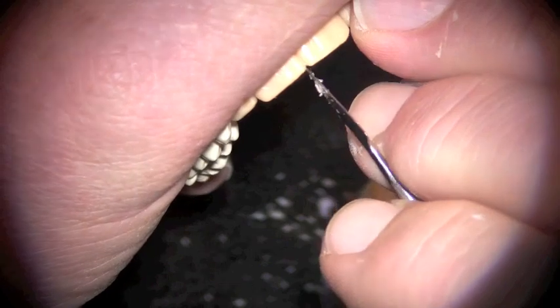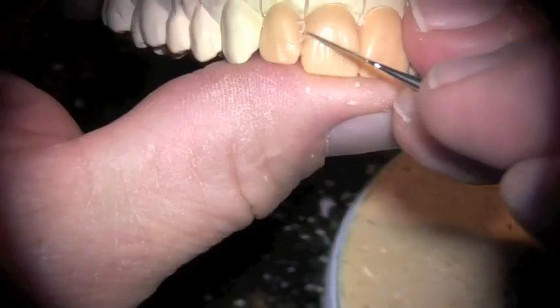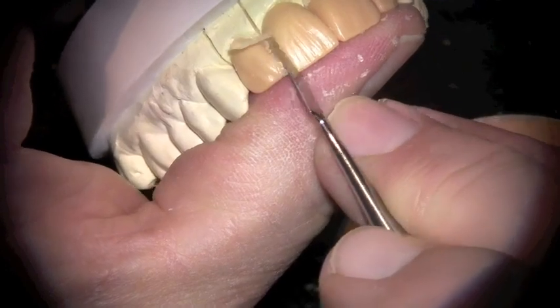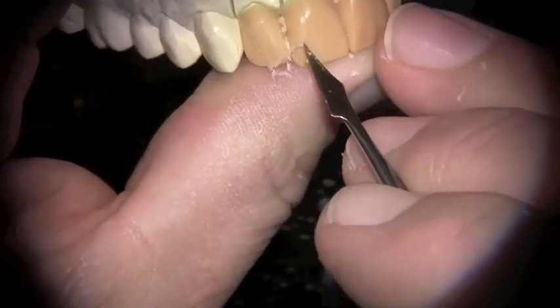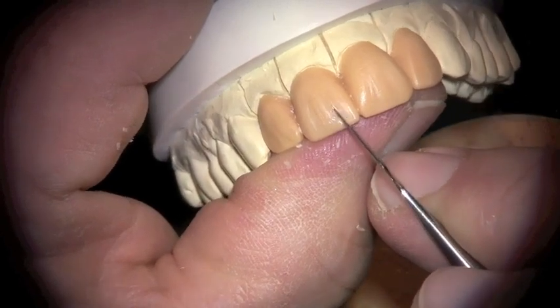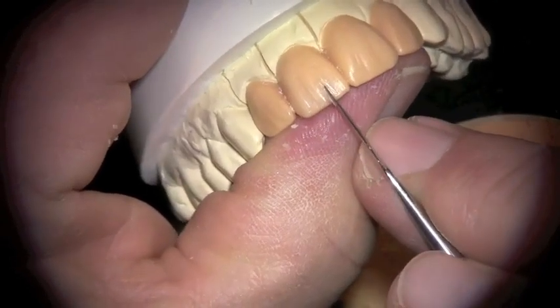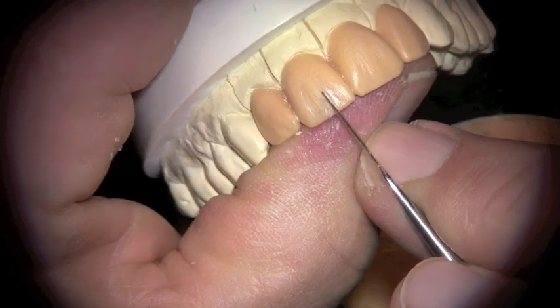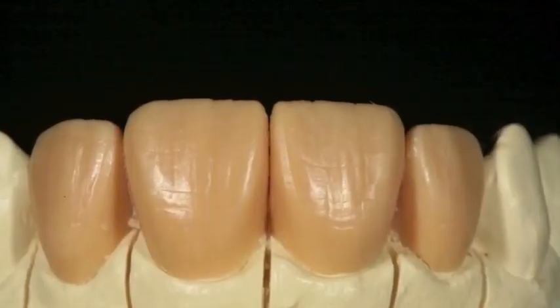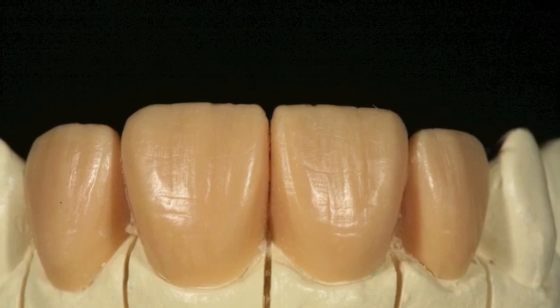Here I'm just refining lobe formation shapes, looking at the incisal silhouette and the midline embrasure. Again, narrowing the appearance of that distal lobe by creating a little bit more deflective surface, and then defining my fine surface anatomy. Creating the triangular depressions there. So here's a picture of the final wax up.